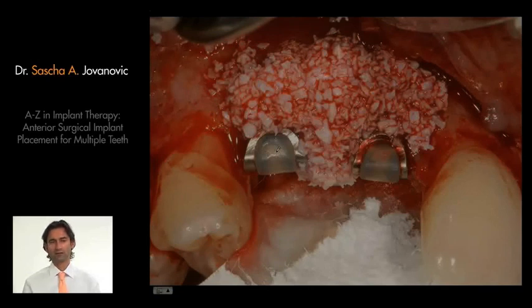To prevent this filler material from migrating and moving around, I place a membrane, and that's what you can see here. But it's a resorbable membrane. And this resorbable membrane will go from the palate, cover the implants and the bone graft. It will cross over the crest, and it will cross the bone between the two implants, and it will be moved to the buccal to cover everything. This membrane again will separate the flap from the implants and from the bone. So it will allow this tissue to stabilize. So this is a nice treatment from a standpoint of healing.